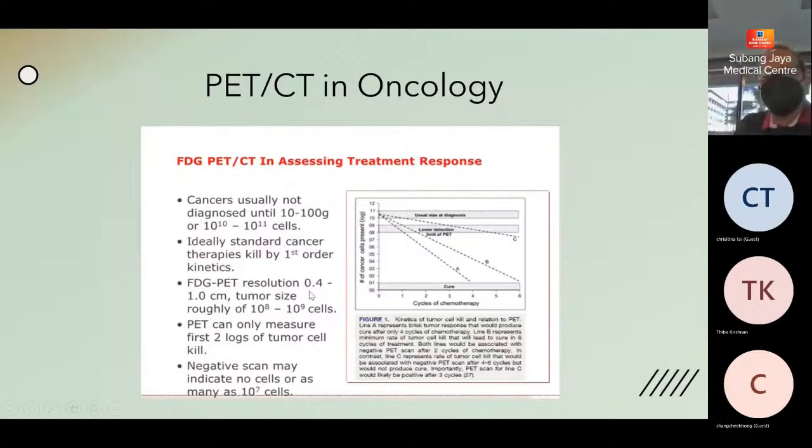So this graph shows the tumor burden after the first few cycles of chemotherapy. Now, as you can see, after the first 2 cycles of chemotherapy, the lower detection limit of the PET is reached, and we can't see anything, everything is clear. This particular level is reached a bit later with these 2 treatments, but at the end of the 6 cycles, they reach 0. Exactly, I wouldn't call it cure, but basically remission.